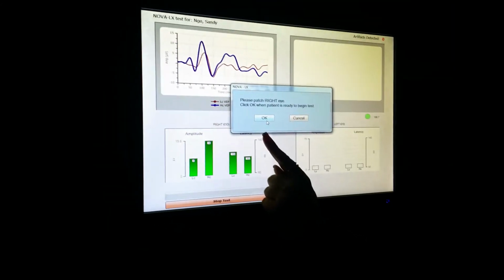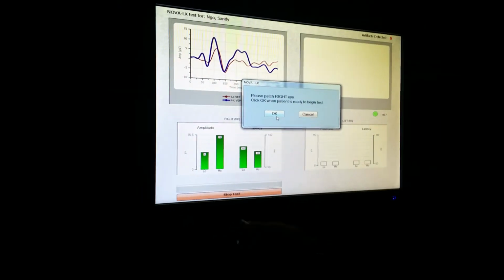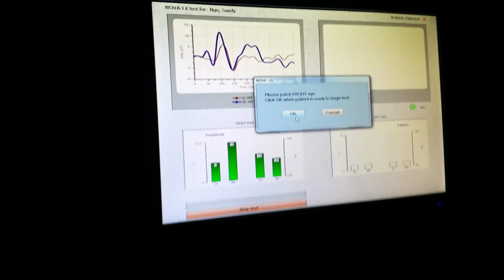And now this box is going to turn blue. That's just another visual cue for you guys that we're going to move to the other side. So we're going to have her go ahead and switch that around. Cover your right eye. Blink a couple of times. And look straight ahead. Here we go.